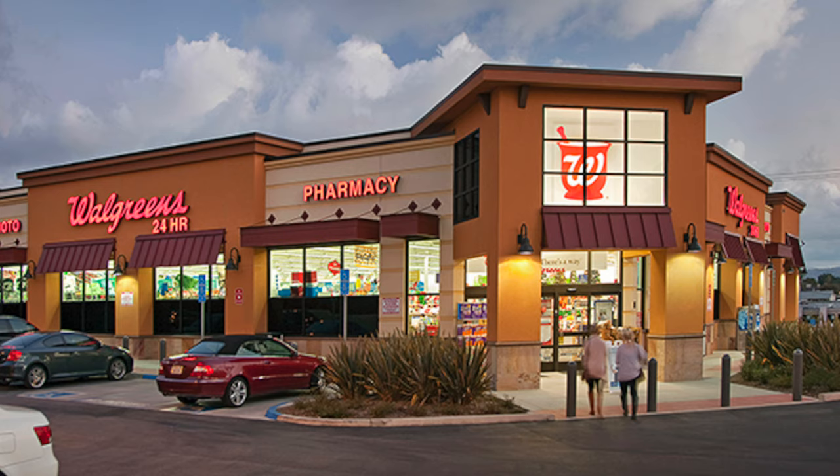You can find Earwax MD and other products from Eocera on the shelves at stores like Walmart, Walgreens, CVS, and other national retailers. If you want more information about Earwax MD or any of Eocera's other products, you can go to their website at Eocera.com. At the end of the day, not all earwax removal products are created equal — in fact, some of them can not only be dangerous but can even make the problem worse. So if you're trying to self-remove your earwax from the comfort of your own home, you are now significantly better equipped to do so, especially if you get the right solution.